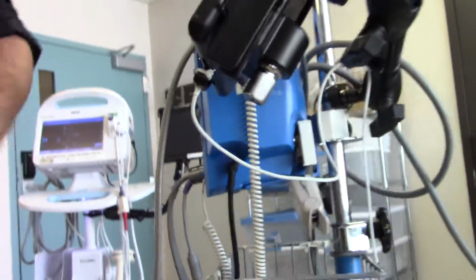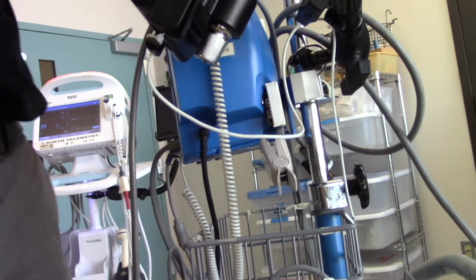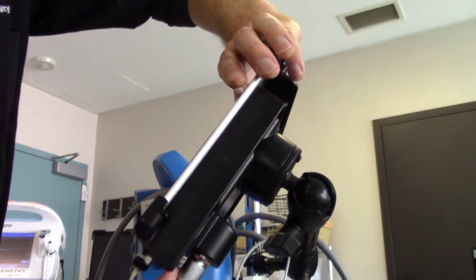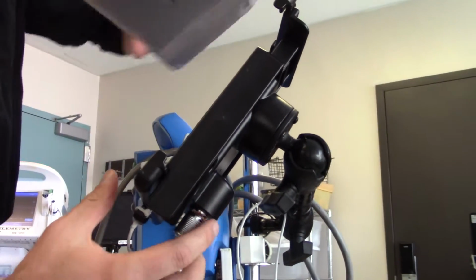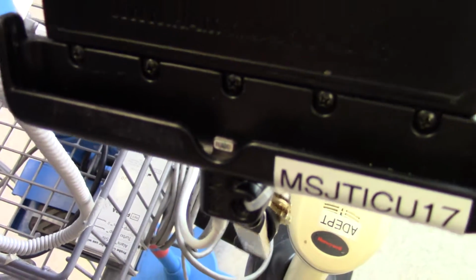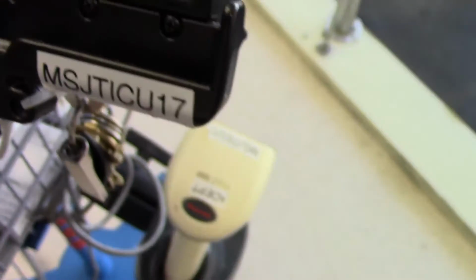Let me find my key here. We can see if this one's showing corrosion. But what you do see is corrosion in the charging ports, which I clean out whenever I try to open these up. Oh, wonderful! That one was unlocked. If you look at the charger port down here, it's got a little bit of greenish corrosion on the copper contacts, and that's something we have to clean off pretty frequently because they don't charge. And then the charging port also takes a fair amount of damage.